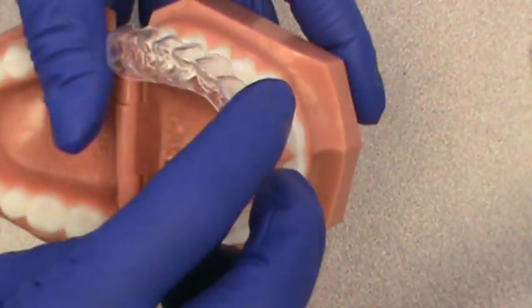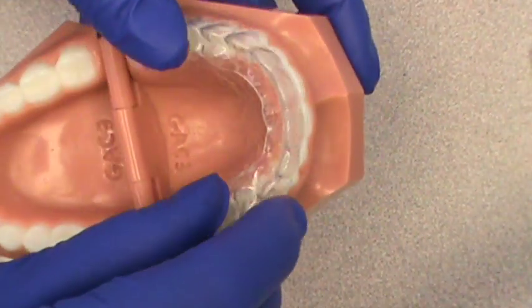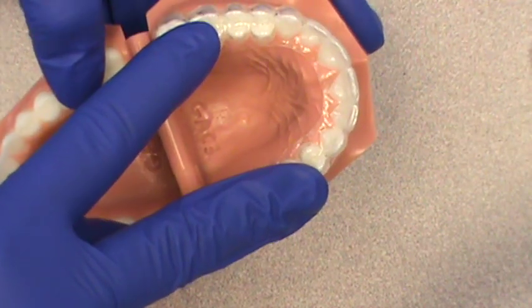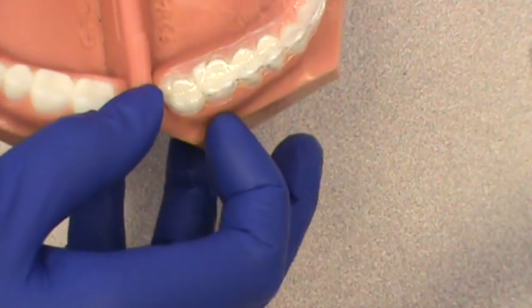Probably the most important thing you want to remember is when you put it in, you don't want to bite it into place. You want to gently put it in there with your finger pressure. To take them out, you want to make sure you pull down on both sides at the same time and dislodge the retainer.